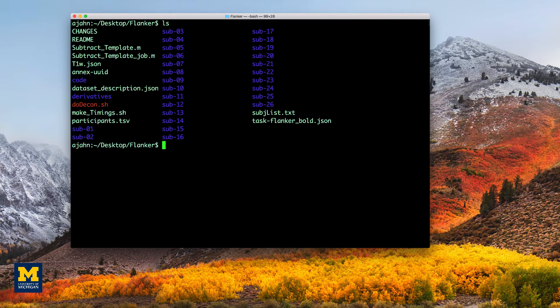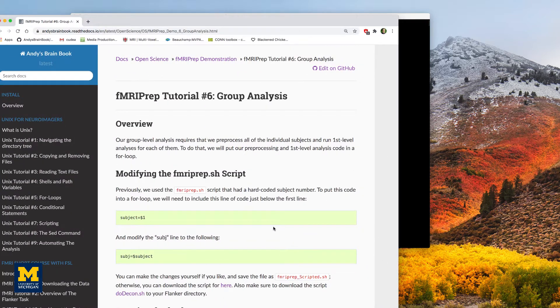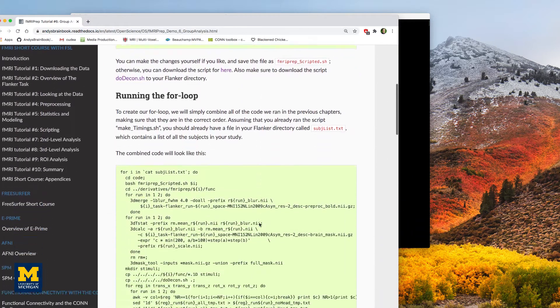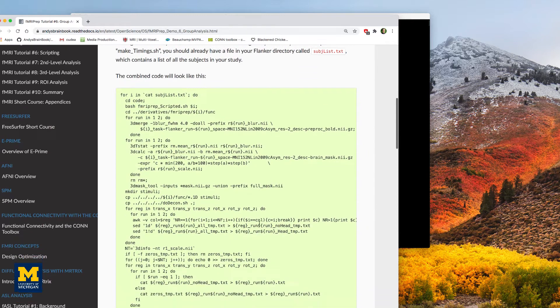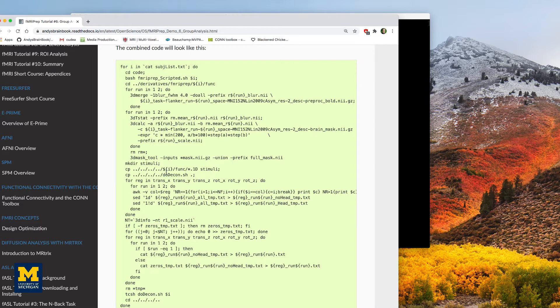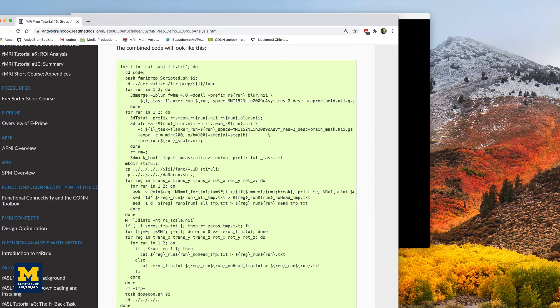The combined code for the for loop will look like this, which you can find on the brain book. Each block of code is discussed in the previous chapters. The only difference is that we now use variables for input where appropriate. You can either copy and paste this code into the terminal while in the Flanker directory, or download this script from the GitHub page in the link down below.